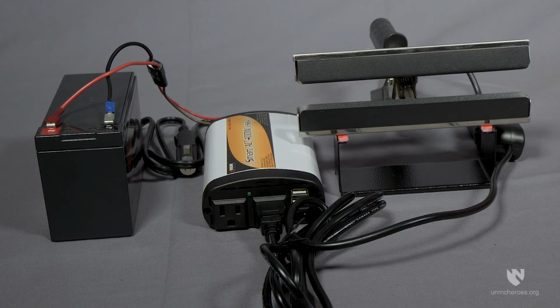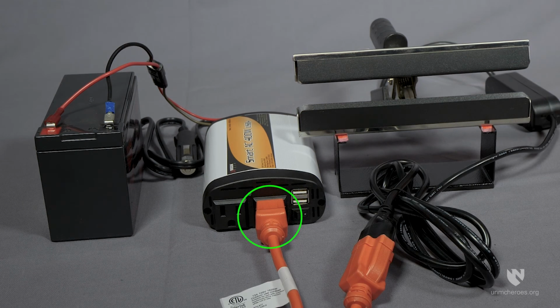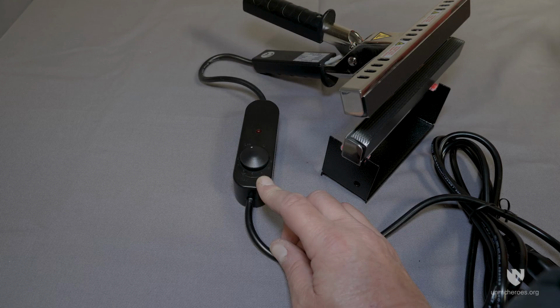After connecting the inverter to a power source, the thermosealer can be plugged into the inverter directly or via an extension cable. This choice will depend on the distance of the processing site from the power source, condition of the power source, and the preference of the user. At this point, the thermosealer can be powered on and allowed to reach temperature.